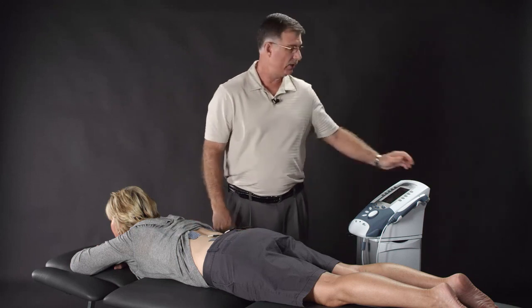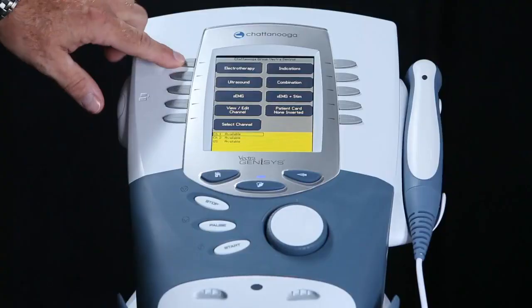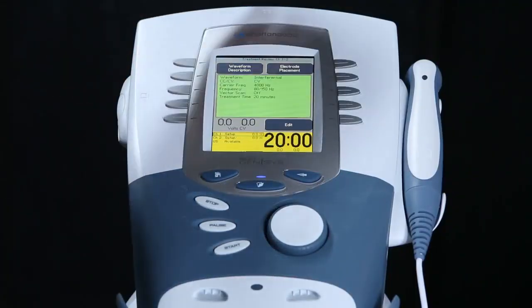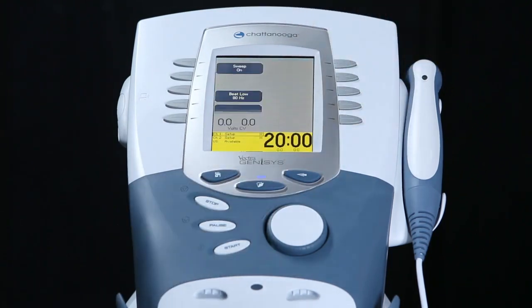Now, let's turn the machine on and get started. First thing we want to do is we want to press the electrotherapy key. Then we press the interferential key. And now we want to edit the parameters to get our correct therapeutic effect, so we press the edit key.